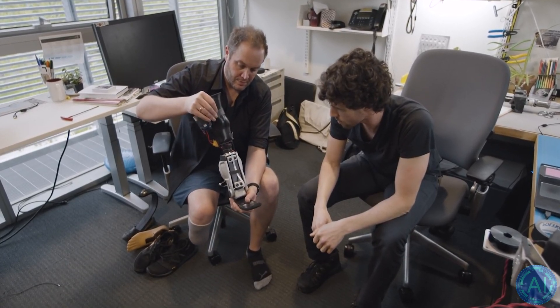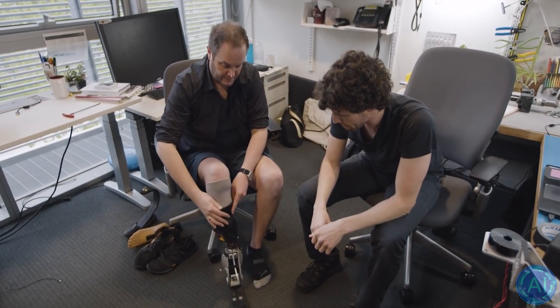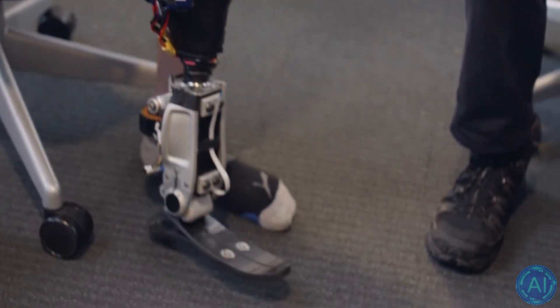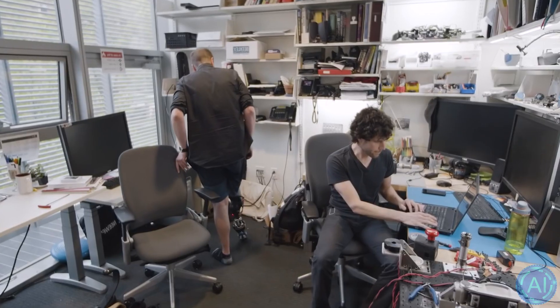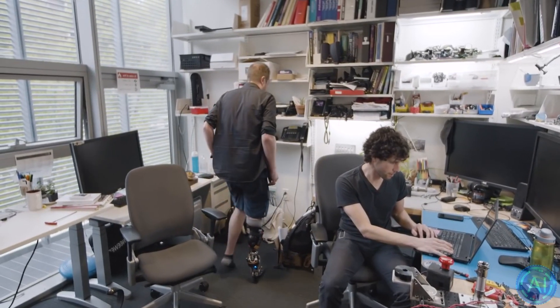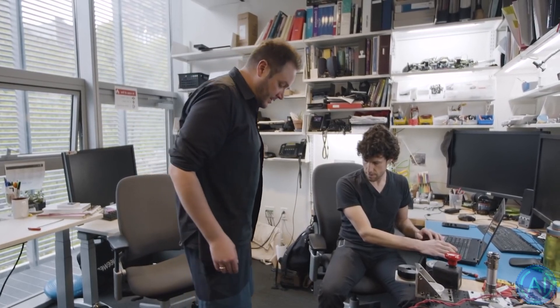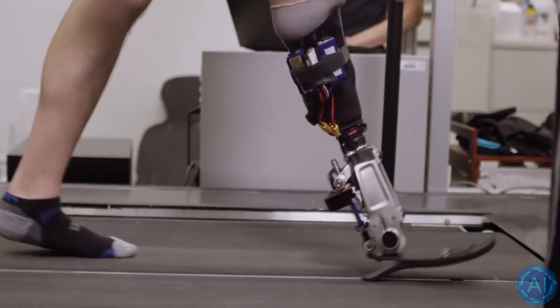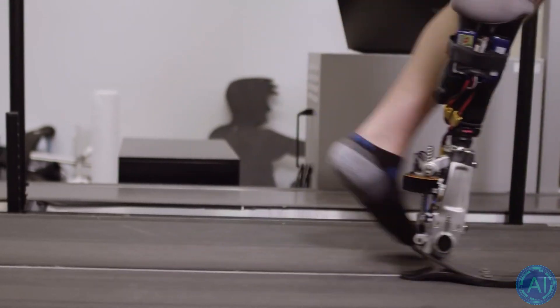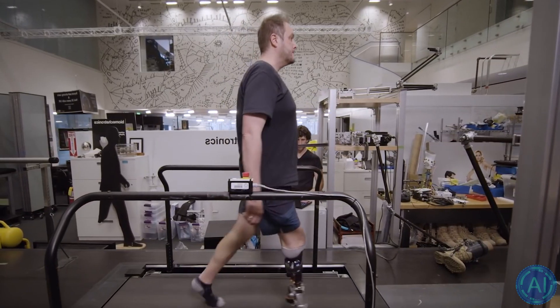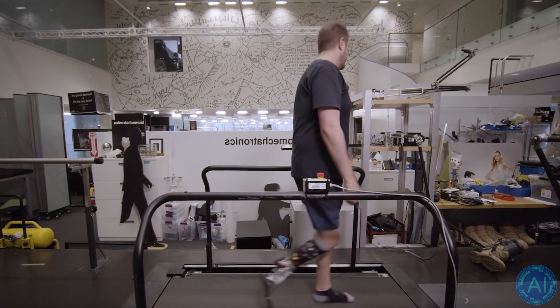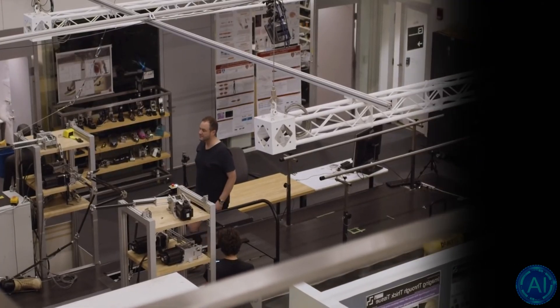In the meantime, MIT started creating the bionic leg for him to wear and wrote the software so he could move it in a natural way. After the surgery they started connecting the robotic limb with the lower part of his leg so that it could read the neural movements and send back signals of touch via electric currents. This experiment is part of a larger research conducted by MIT to eventually enable any amputee to get improved bionic limbs to improve their quality of life.